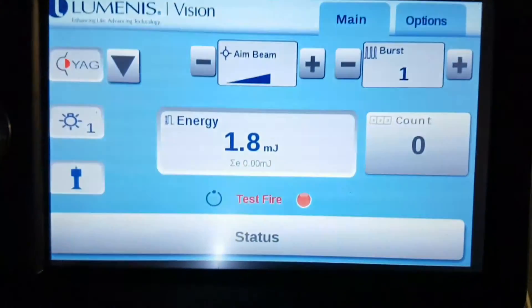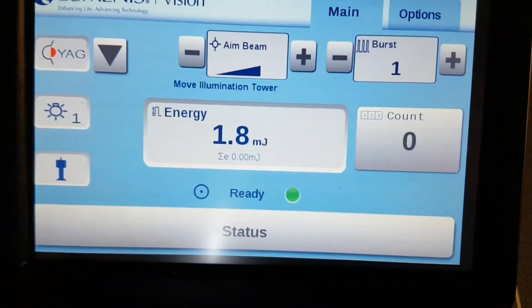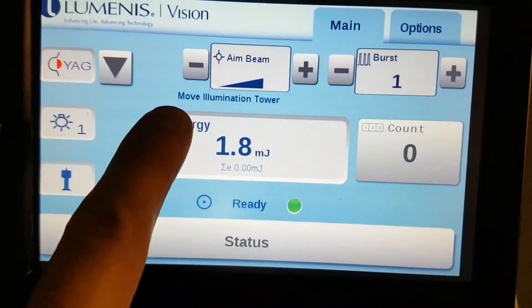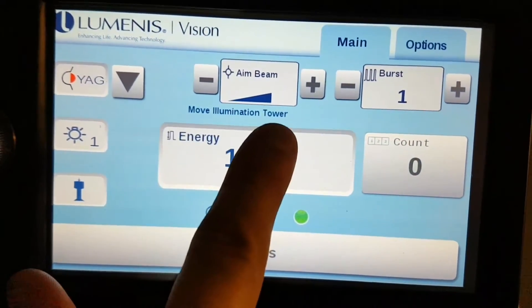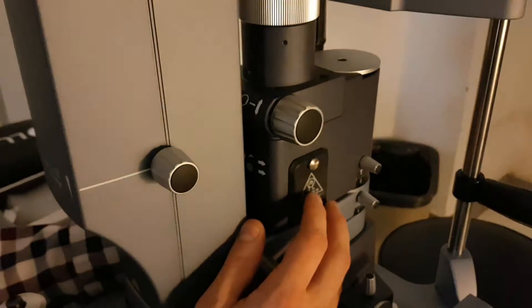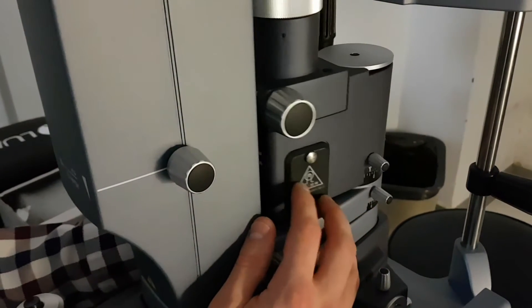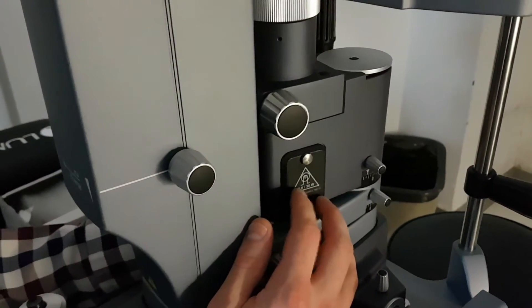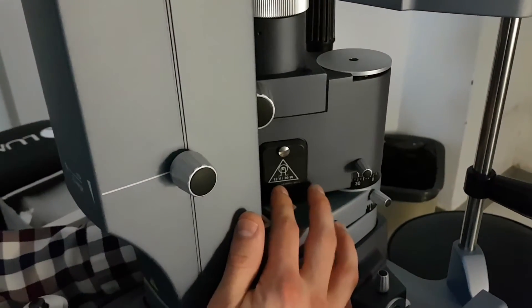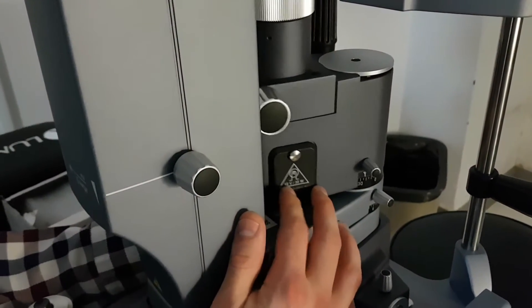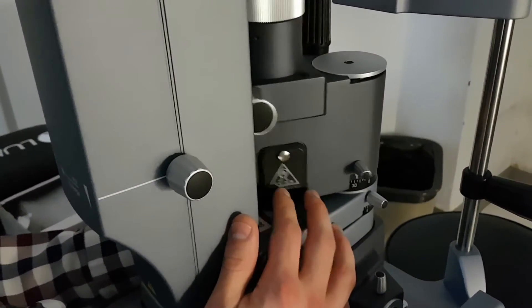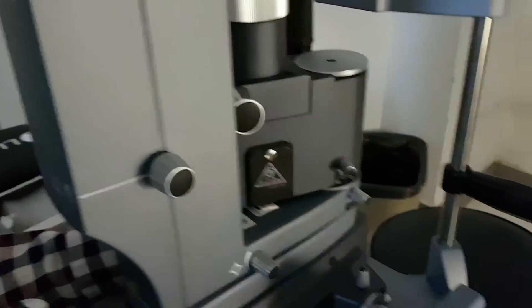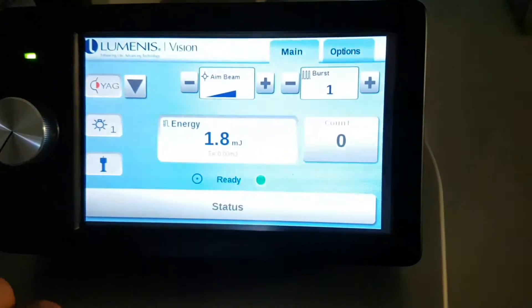This means that the illumination tower is in front of the laser. Once you've moved it, you can hear a little click where the limit is. You'll see that message disappear.